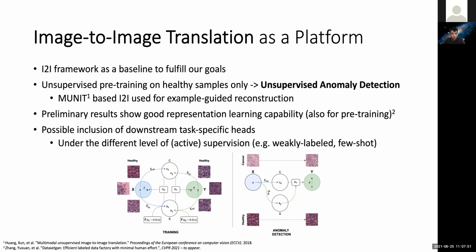in histology imagery by using a recent unsupervised image-to-image approach that disentangles content that needs to be preserved apart from style during this translation process, which is particularly suitable for digital pathology. We achieved that by pre-training. Basically, we performed image-to-image translation just on healthy samples, with which we effectively learned normal visual representation.